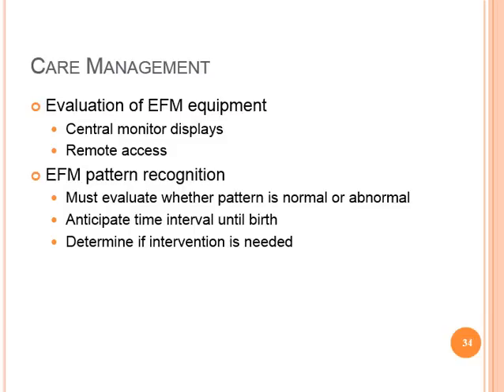EFM pattern recognition. Nurses must evaluate many factors to determine whether a fetal heart rate pattern is normal or abnormal. They evaluate these factors based on the presence of other obstetric complications, the woman's progress in labor, and the use of analgesia or anesthesia. They also must consider the estimated time interval until birth. Therefore, interventions are based on clinical judgment of a complex integrated process.